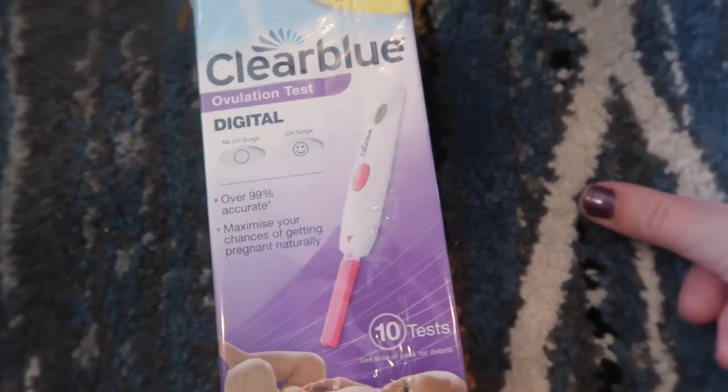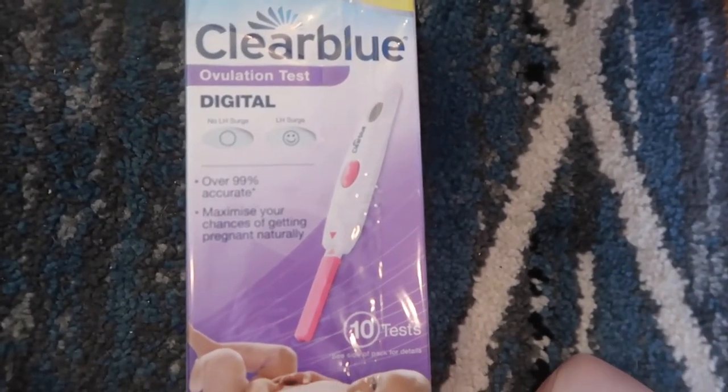So this is the first month we've used them to officially try to conceive. I am reviewing the Clearblue Digital Ovulation Test.